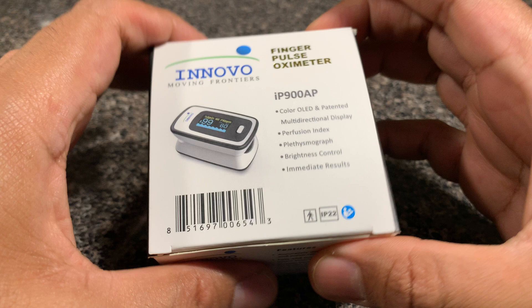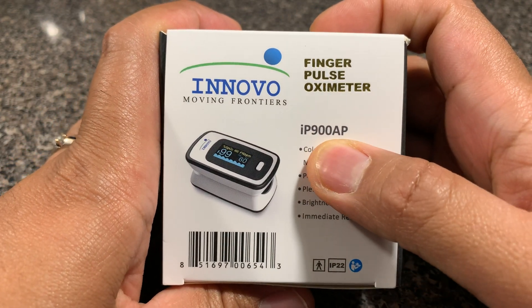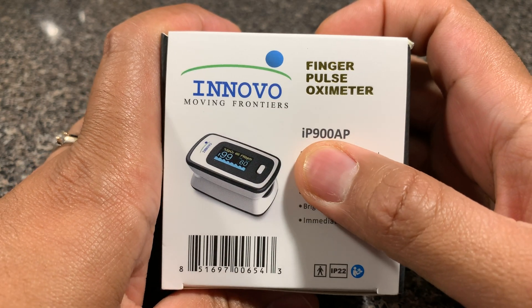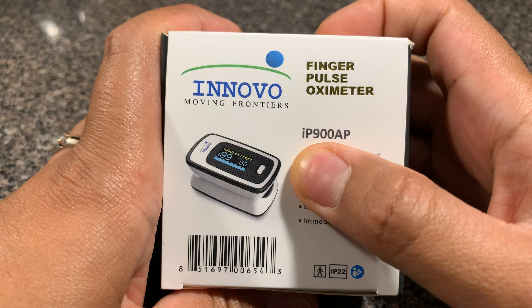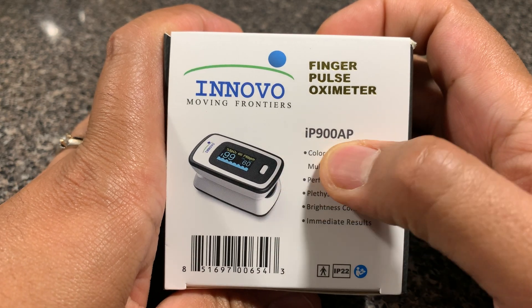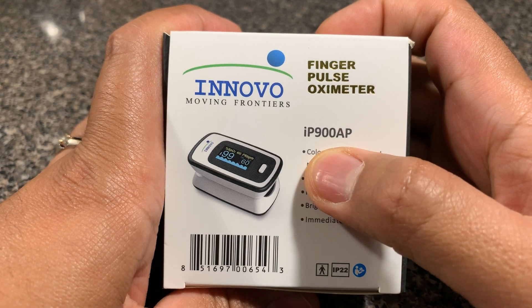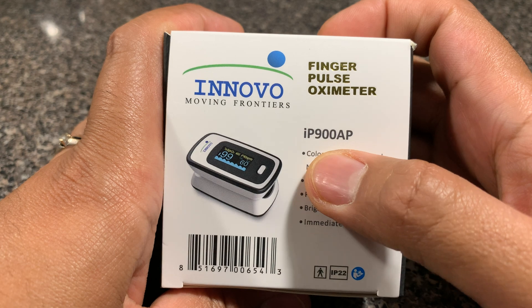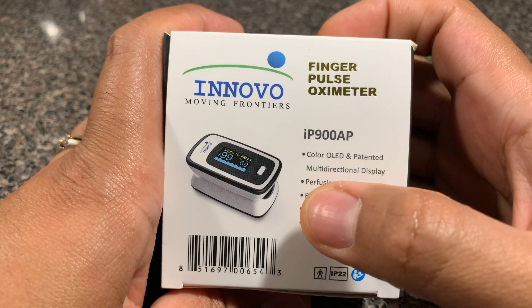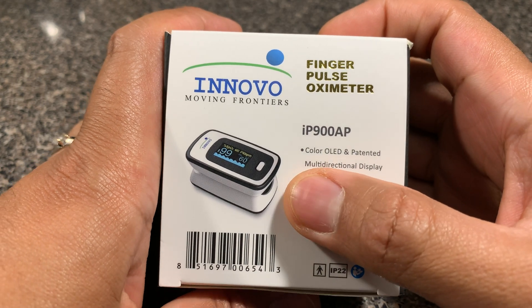As far as the packaging is concerned, it says IP900AP. One thing to note is that the company Innovo offers this in two variants: IP900AP and BP. The only difference between the AP and the BP is that the AP version allows you to set the beep and alarm function on this unit, while the BP version does not. But otherwise, they are fairly identical products.